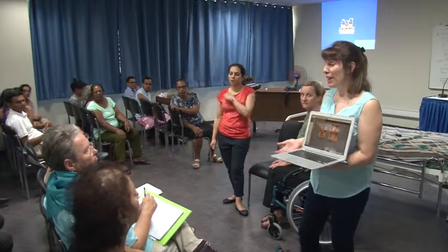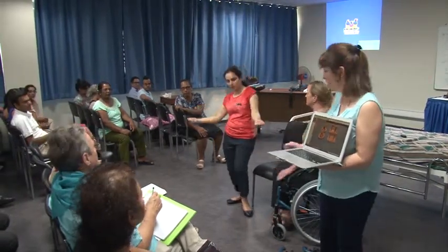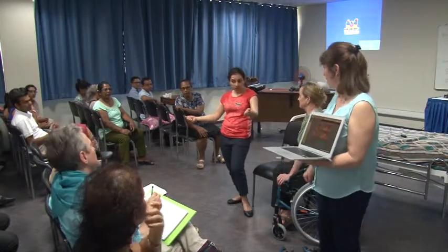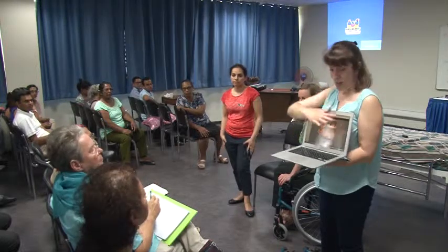They're good enough to do the job. They're just not quite so stable. They tilt a bit, especially on a bed. On a bed, they just roll out because they flip a bit. These are nice big flat bases on wood, and it's just got the rubber, the anti-slip rubber stuff that we use.